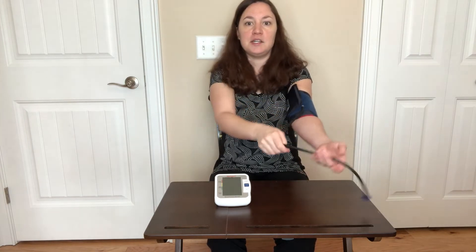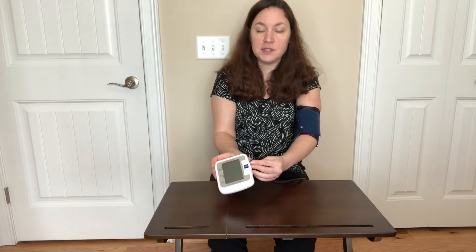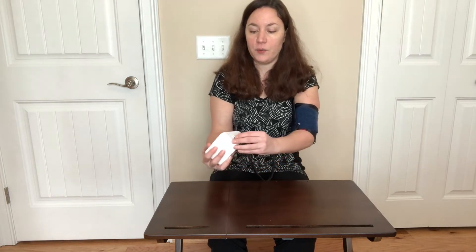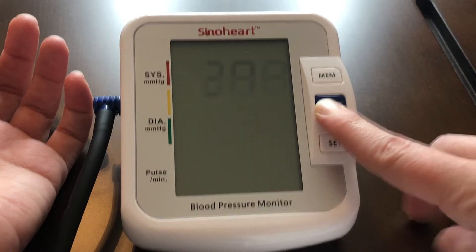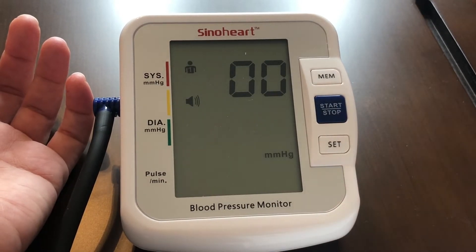Then you simply plug it in right here on the side. This is a simple stop/start button, so it's nice — it's even great for the elderly.